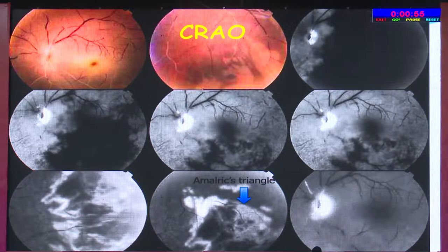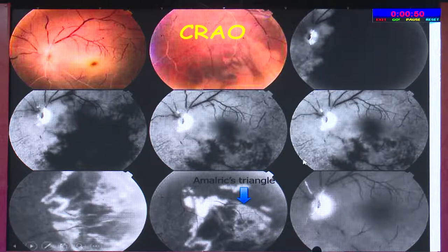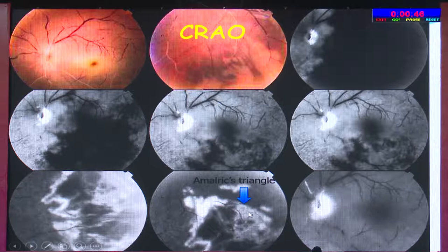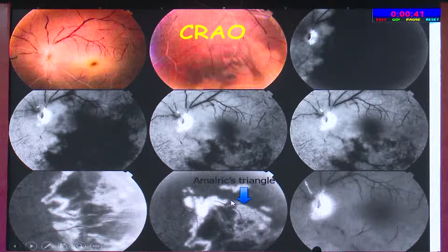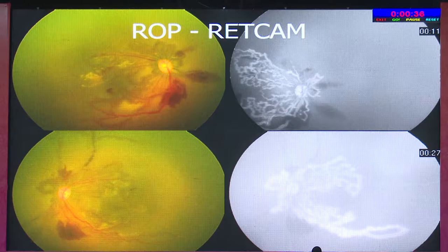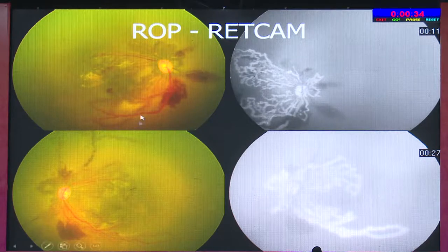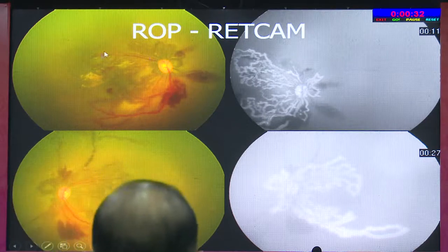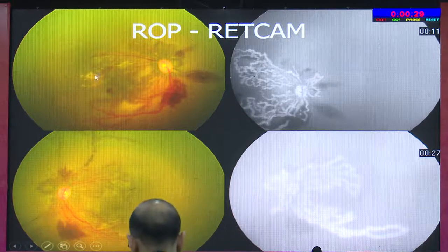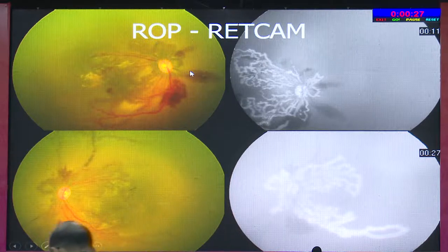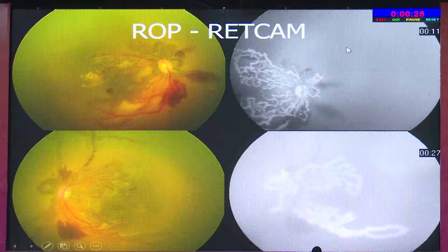In CRAO, angiography helps determine whether it is a reperfused CRAO. In posterior ciliary artery occlusion, you can identify the Amalric triangle — a hyperfluorescent triangular area with its apex towards the posterior pole. In ROP, angiography is very useful to delineate the small vascularized island in the posterior pole and clearly map the entire area of avascular retina.